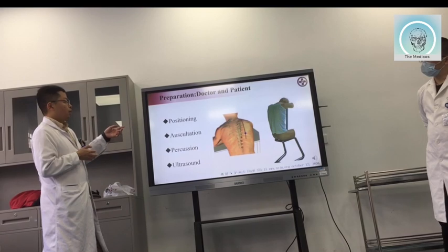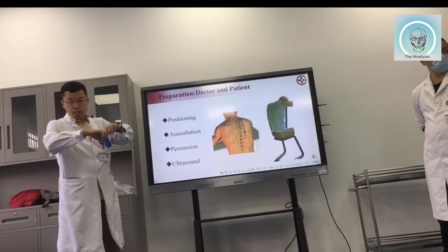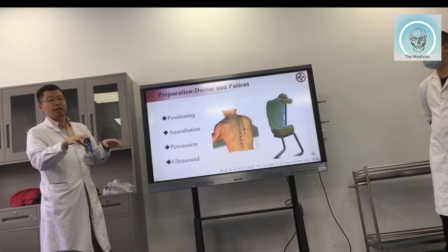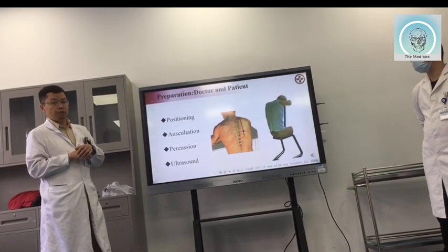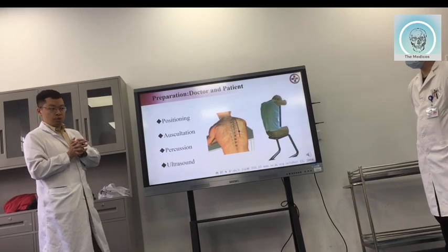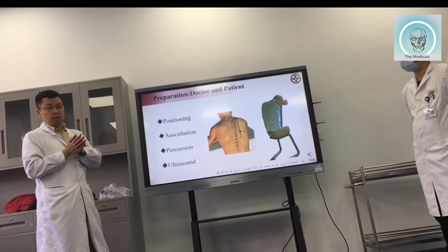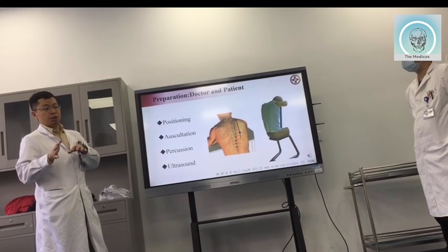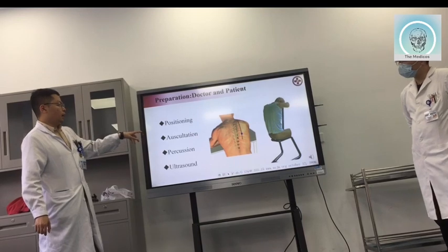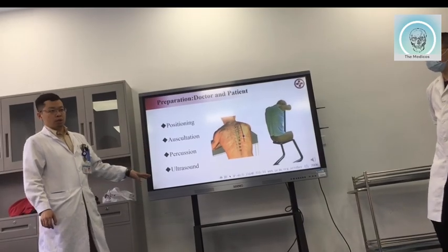And here, then we will put the patient in a certain position like that, okay? So bending over with the forehead onto the back of the chair. This is the standard position for this kind of aspiration, and this is for the drainage of the fluid. But when you look for the pneumothorax, when you drain the gas out, it's a different position. You should just lay down. And here we should do the auscultation and the percussion, and sometimes we use the ultrasound.